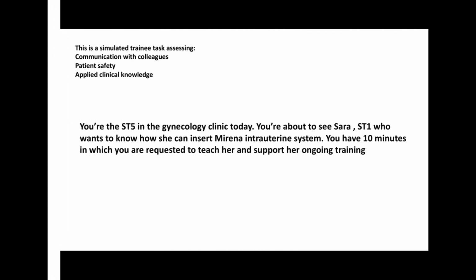So there are some prerequisites we need to do before insertion. First of all, we need to explain to the patient what the procedure will involve, and take her consent. The consent will be a verbal one, because we are doing it without any anesthesia, in the clinic.